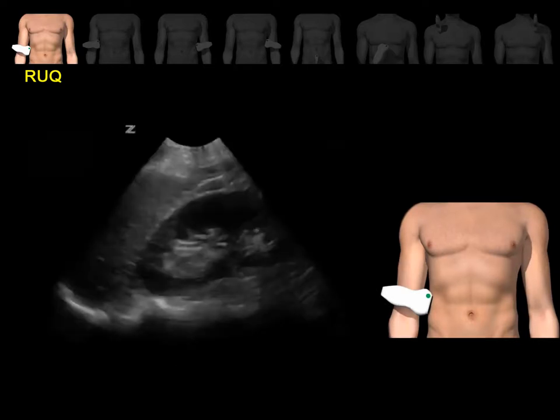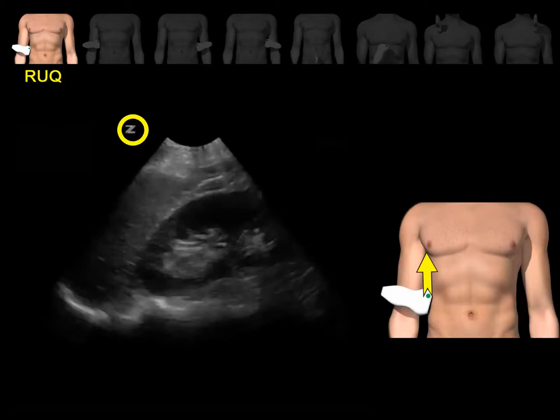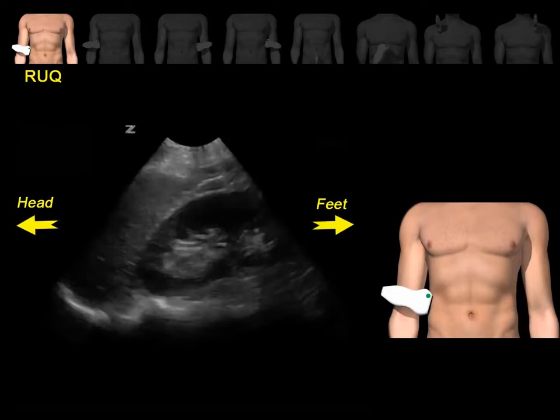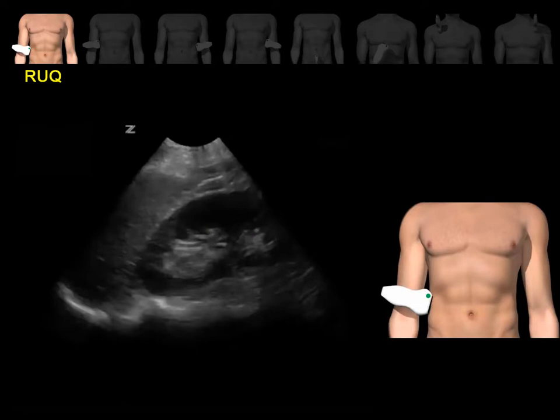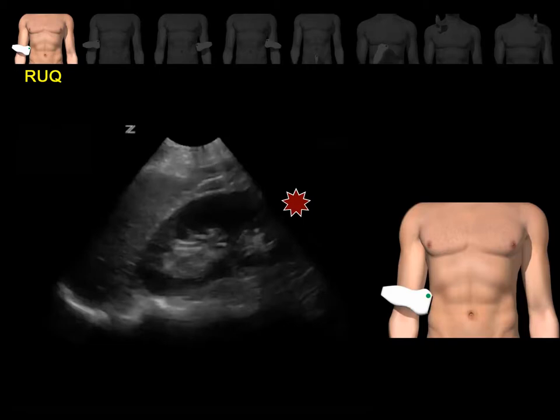This is the image that you should see — a coronal section of the right upper quadrant area. The probe marker is towards the patient's head. This is the diaphragm, this is the liver, and the kidney. These are the spines. The areas of potential fluid collection are between the liver and the kidney, between the liver and the diaphragm, the caudal tip of the liver, and at the inferior pole of the right kidney.